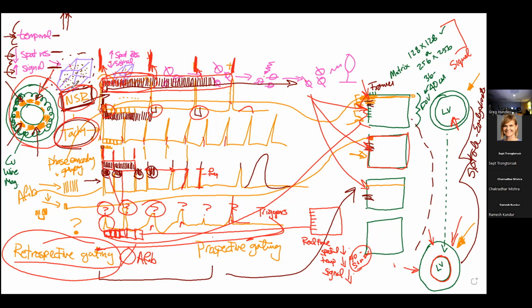However, now we deal with other irregular rhythms. So we talked about atrial fibrillation. That won't work. Okay? You can't tell Chris, Shelley, Terry, anybody, use retrospective gating in AFib. I know it works. Wrong. You've got to switch to prospective gating. And when you switch to prospective gating, you are assuming that systole doesn't change in time. That's what we talked about right here. And that's a correct assumption. And the images come out quite nice.